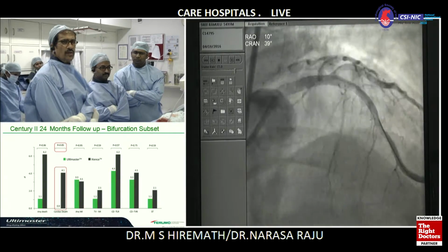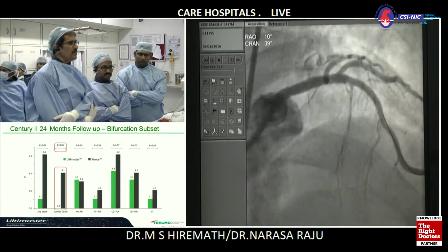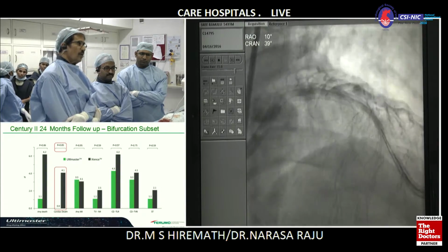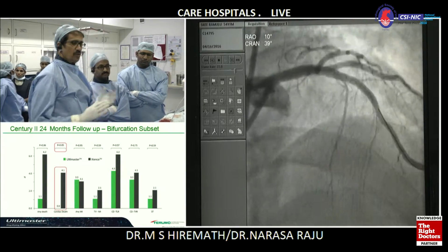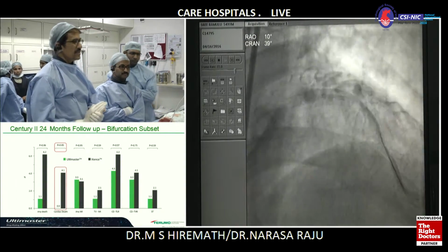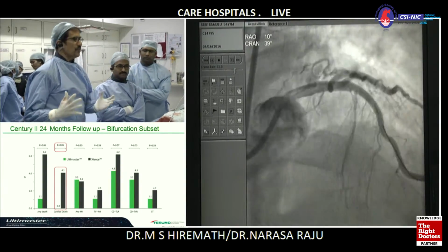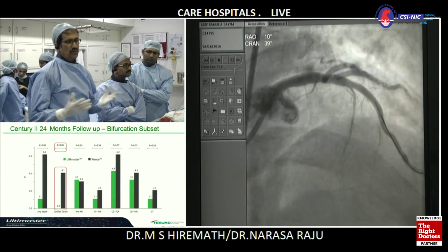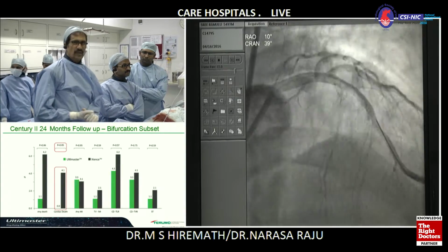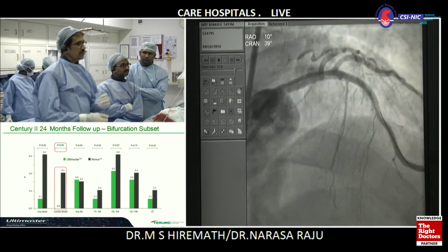I think all of us in this particular area, I would continue DAPT cover for at least 1 year. The good coating on the stent at the end of 3 months suggests that you may withdraw it for a little while if you need to, like if you have a dental extraction, you can feel safe withdrawing the DAPT cover. Show the previous view. I think, yeah, I agree.